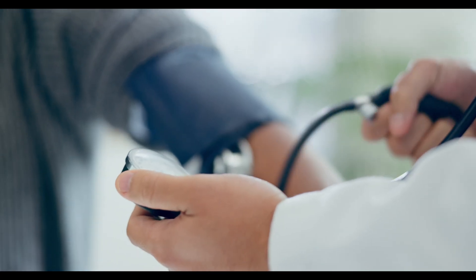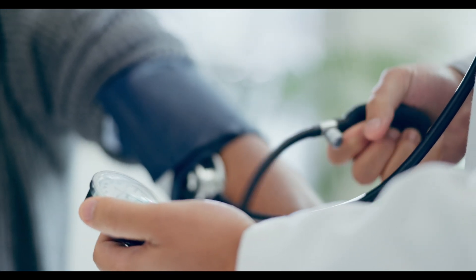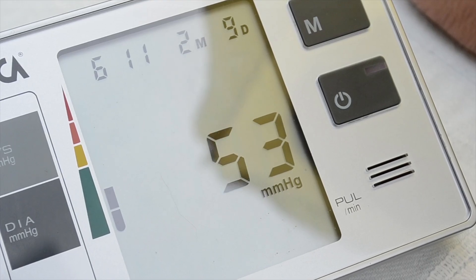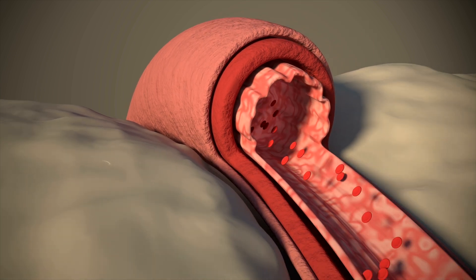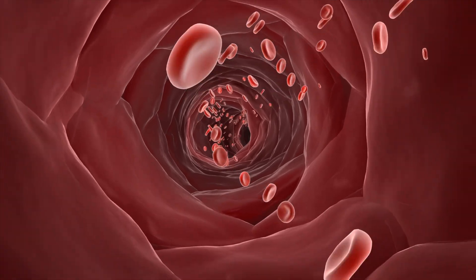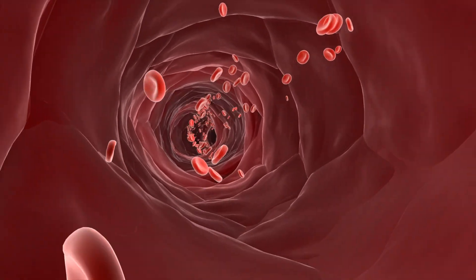Usually blood pressure is measured with an arm cuff. The cuff fills with air until it is tight against the arm, briefly stopping blood flow. The device then measures two pressures: systolic and diastolic. Systolic pressure is measured when the heart beats and pumps blood through the arteries, while diastolic pressure is measured when the heart fills with blood during its resting phase. This results in a blood pressure reading of, for example, 120 over 80, both values measured by inflating and deflating the cuff. The downside is that these devices are quite bulky and heavy, so it's not easy to carry them around.